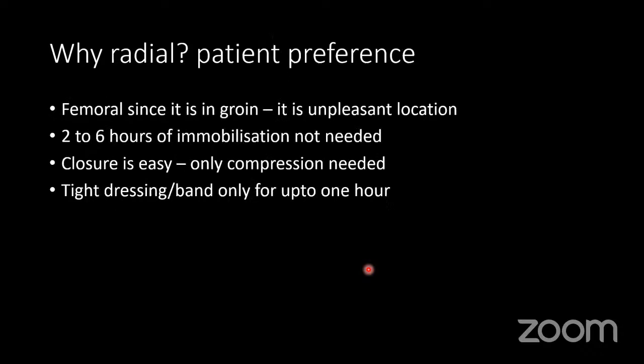And from the patient perspective, the femoral puncture is in a very unpleasant location since it is in the groin. It is not in the leg, and 2 to 6 hours of immobilization is not needed for radial, and the closure is very easy, and the compression is not cumbersome.